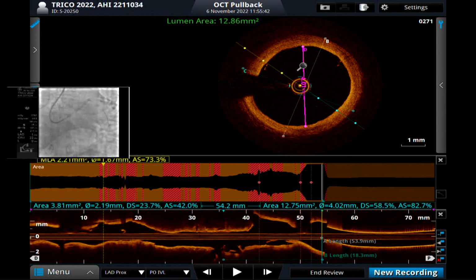So why not take a 5 balloon? 5 is a little bit bigger, I'm afraid, because it is completely normal. In my practice, in all honesty, I think 4.5 is okay. Yeah. You take a 5 balloon.